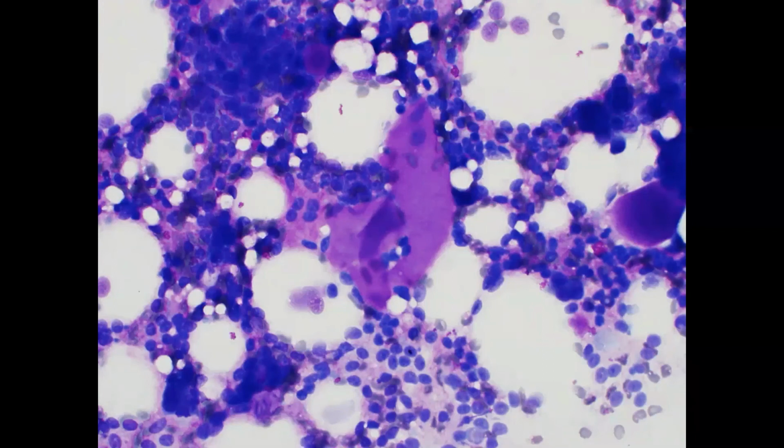Also in an adenoid cystic, in addition to the nice round spheres of stromal material, we may also have these more irregular fragments of stroma as well. So they're not round like the gumballs in adenoid cystic, but you can appreciate that this is still worrisome in that this is an irregular fragment of stroma, but again, the cells are sharply demarcated from it, and it's not fibrillary. It's very homogeneous and hyaline. So these fragments of hyaline stroma, even though they're not as specific as the gumballs for adenoid cystic carcinoma, in the right context, these are still worrisome and should get your attention and get you thinking about something like an adenoid cystic carcinoma.